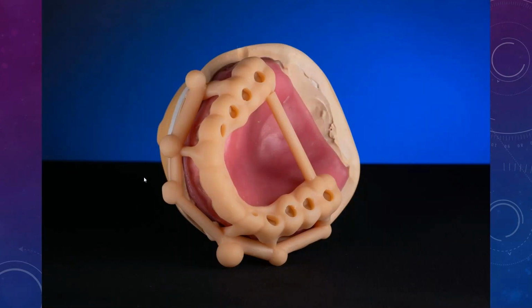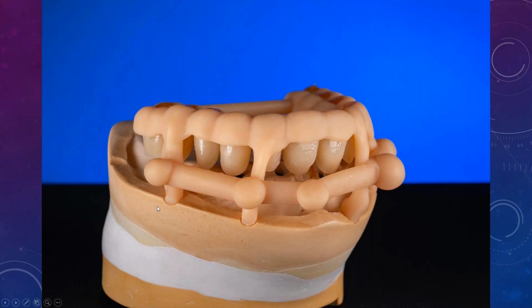This is the latest and greatest, version 3.0, as I say. I make these cages now. So basically this cage fits over the teeth, and I make these little grooves on the model. And this cage is used for 2 things. Number 1, I scan it as an opposing, and that allows me to see where the teeth will start. And the second thing is, once the bar is fabricated, I can utilize that cage to reset the teeth onto the bar. And what's great about these cages, they're rigid and not flexible like the putty, so it doesn't create as many changes in the bite when you're resetting the case. Because I've noticed when I'm doing things with just using putty, oftentimes I have to move quite a few teeth to get it realigned. With this, I still have to do some adjustments. It's never been perfect for me, but it's been a lot closer than doing it with putty.